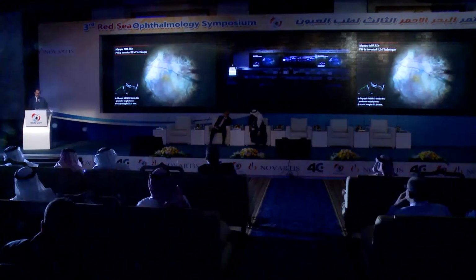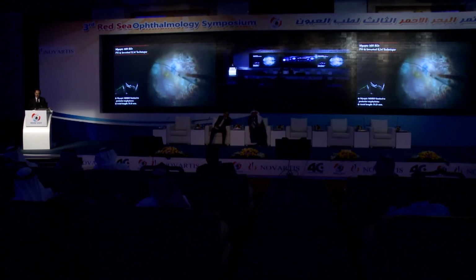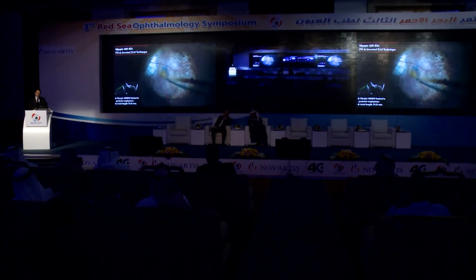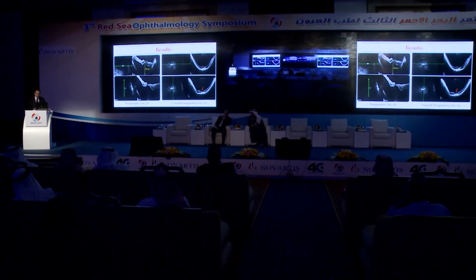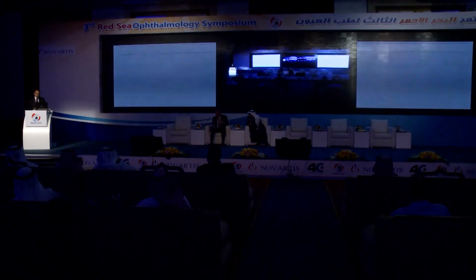So as I said, you may augment the staining in order to have a better view and better result of peeling the internal limiting membrane and get it over the macular area. And this is the post-operative picture. The detachment was relieved, the hole was closed, and with improvement of the visual acuity to 0.3, and this is the picture 6 months after the operation.